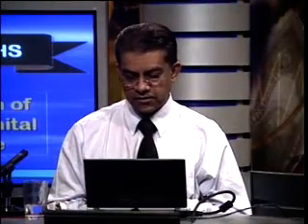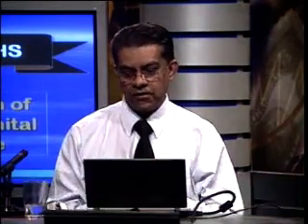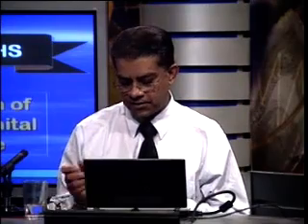This topic is going to make sense only if you have been listening to the previous topic, that is clinical evaluation of cyanotic congenital heart disease, because a lot of them are linked to each other. You don't look at an ECG before examining a patient or clinically evaluating a patient. You always do that before. So when you actually look at an ECG, you should have a lot of prior information about the patient as to what the child is suffering from. And as I was discussing with you, what group of lesions it is: decreased pulmonary blood flow, or increased pulmonary blood flow. So ECG in isolation has really no sense, and I'll come to that later.